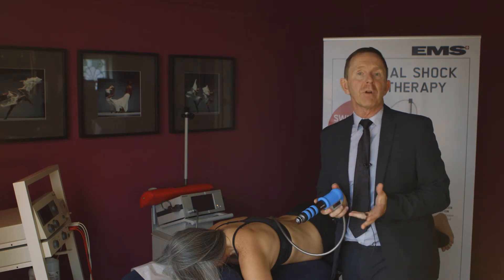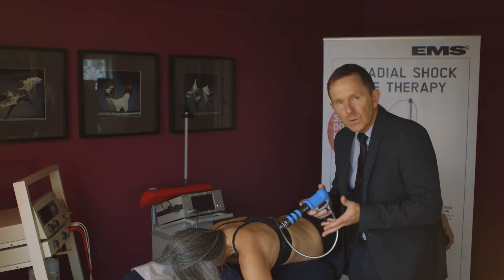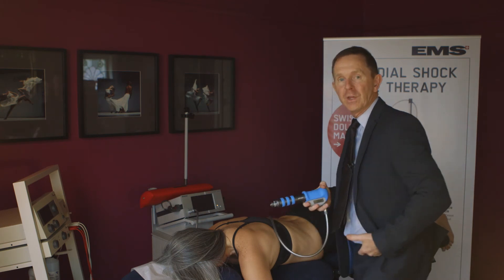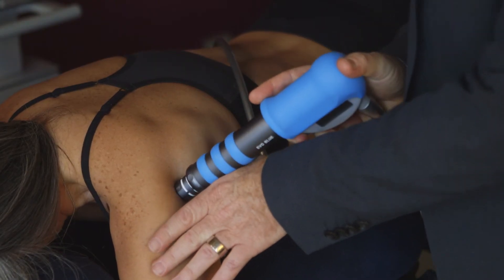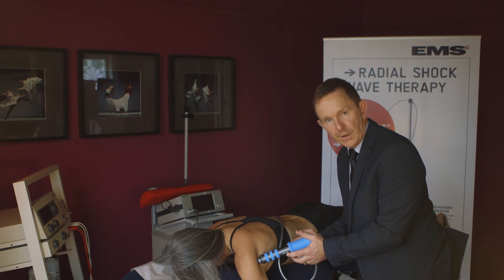And finally, operator posture. It's hugely important. I often see this when we're discussing osteopathic technique. We must feel that we're in the best possible posture when we're delivering the shockwaves. We're applying pressure. Make sure you're in a good posture scenario.